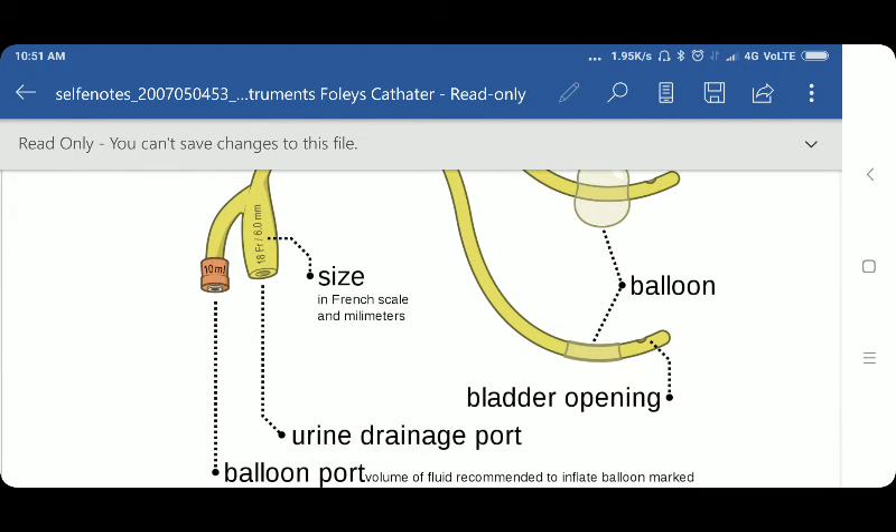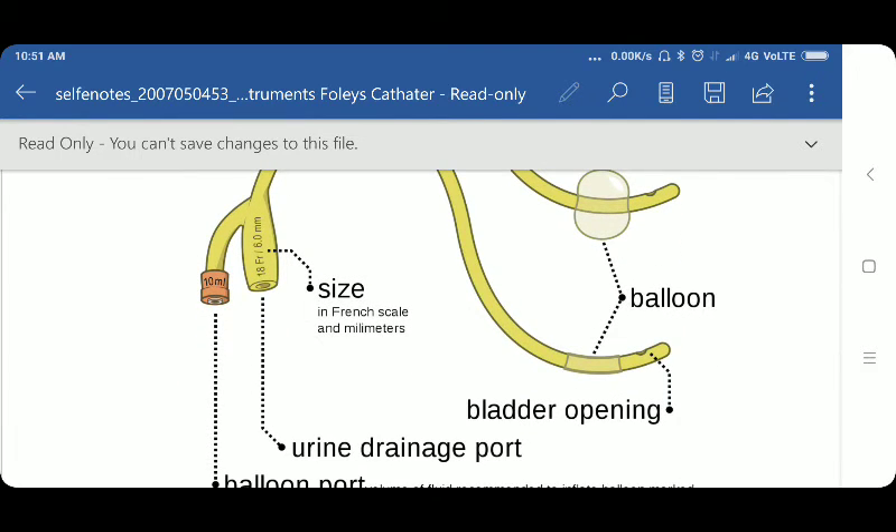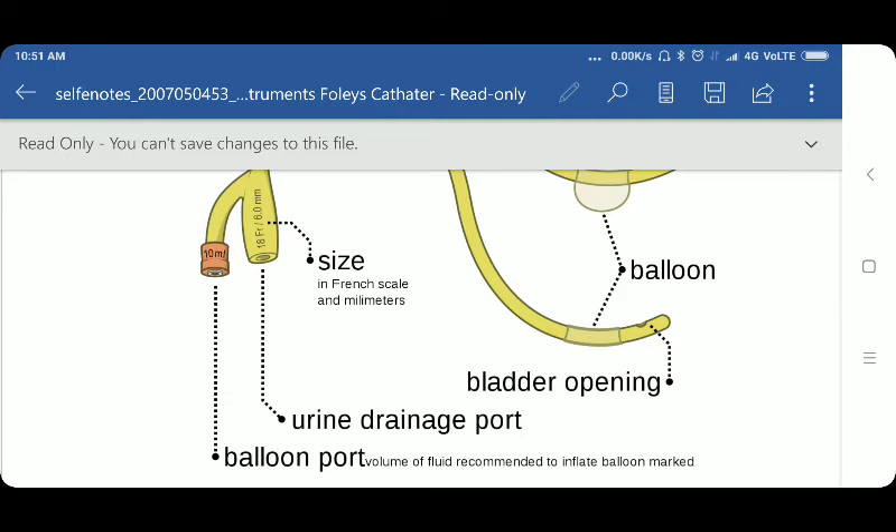The balloon port is used for inflating the balloon. On the balloon port, it is written 10ml or 10cc — this is the capacity of the balloon which we inflate with the help of a syringe. We put inside sterile water or normal saline. The urine drainage port is also provided; through this port, the urine comes out. At this port, we can attach a drainage bag or drain directly.